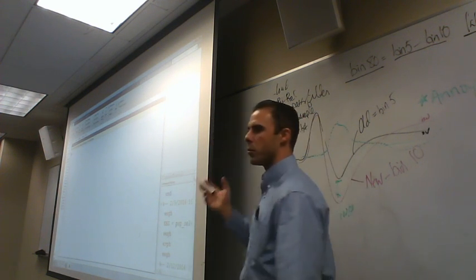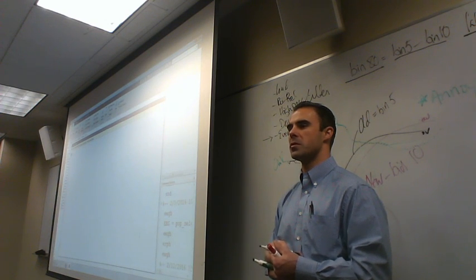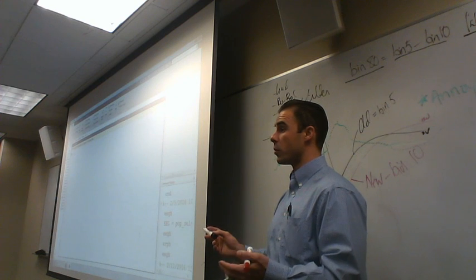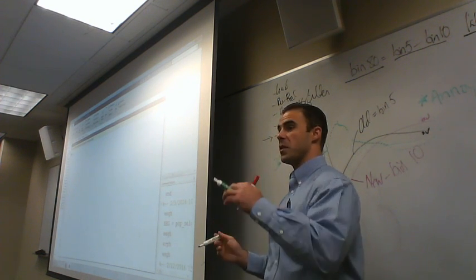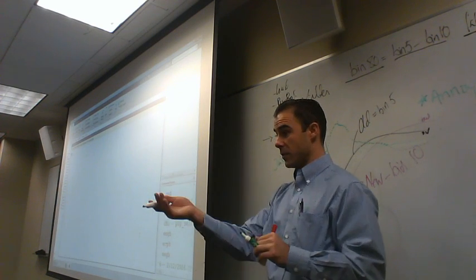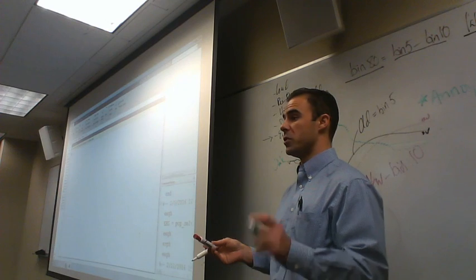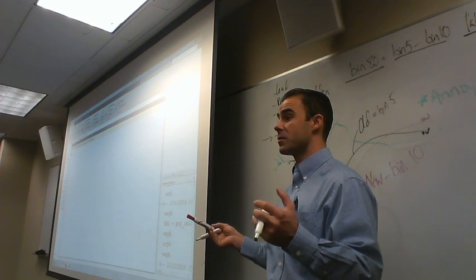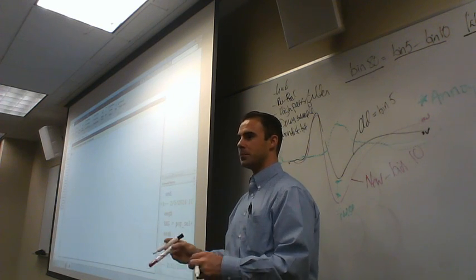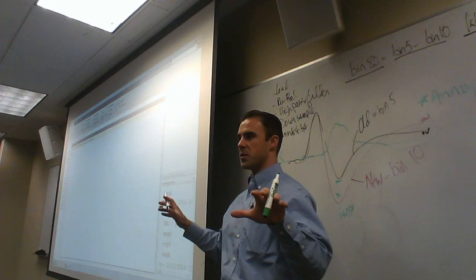This is the second part of that first question. What are you going to do first in the text files? Are you going to do events list or bin operations? And the answer is events list, because what we're doing with the events list structurally within the computer code is first creating a list of every single possible event that we talked about before class. Remember that? And then we give a label to each one of those. That's where we're sorting the socks into different bins. Red socks go in this bin, blue socks go in this bin, white socks go in that bin, and we can categorize based on conditions.